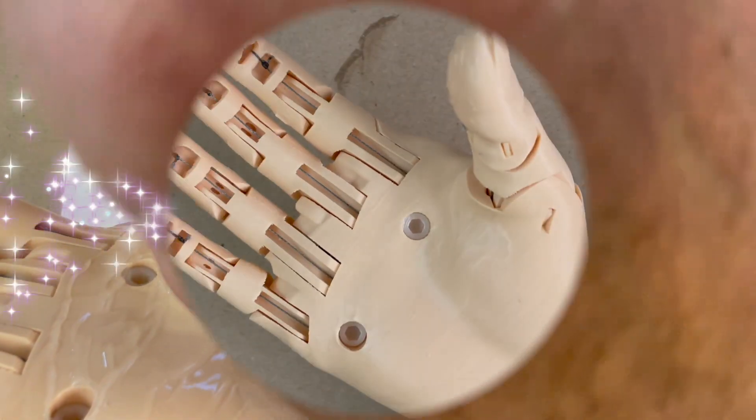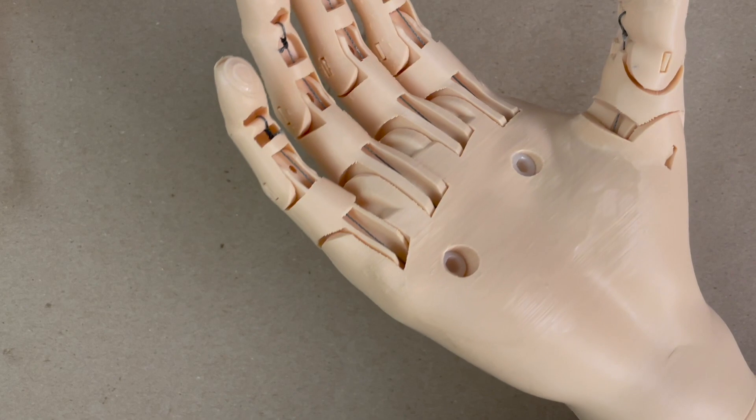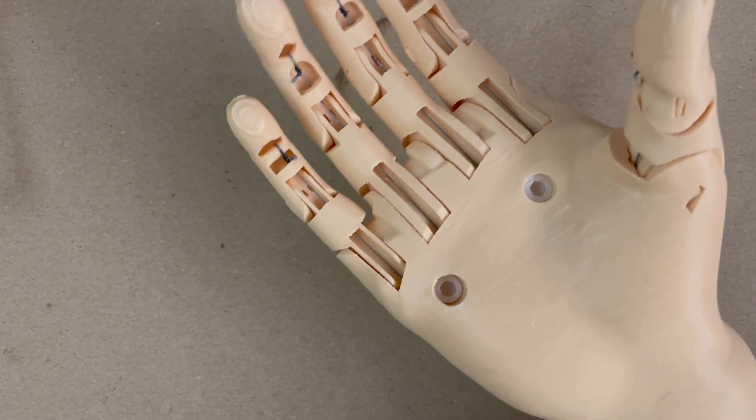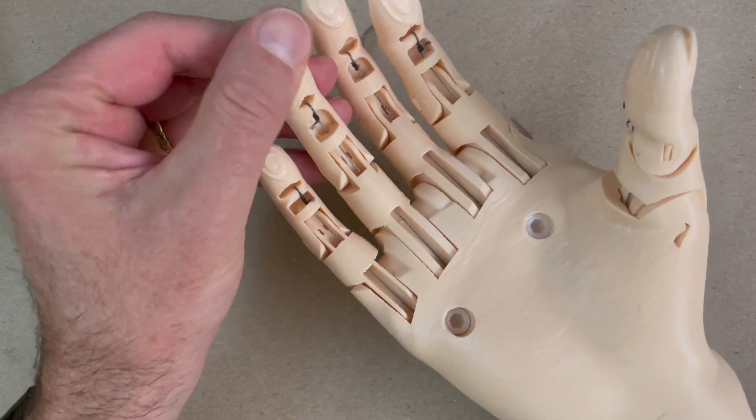Once I've got the Plasti-Dip all over the palm and fingers, I let it dry for 24 hours. You can see it comes out pretty smooth, with a little bit of lumps and discontinuities — that's what I want, as it provides a little bit of extra grip.